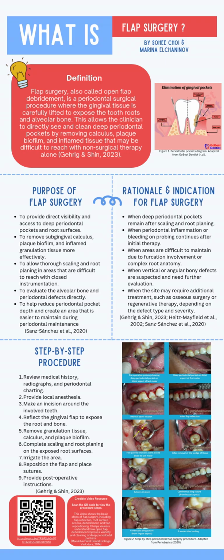The main purpose of flap surgery is to improve visibility and access. With the flap reflected, the clinician can remove subgingival calculus, biofilm, and inflamed tissue more effectively. It also allows better evaluation of the alveolar bone and periodontal defect.